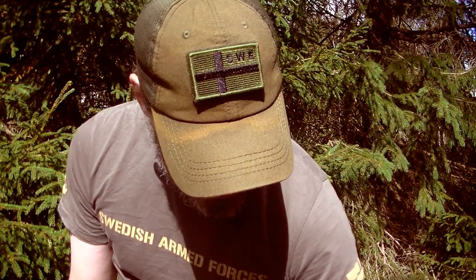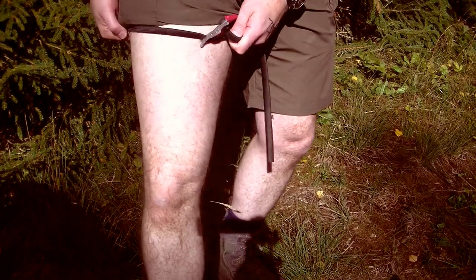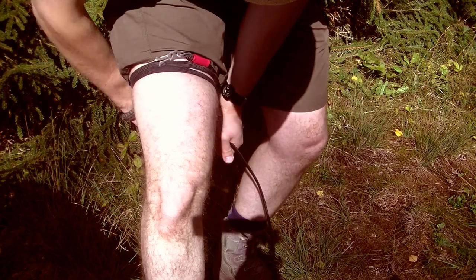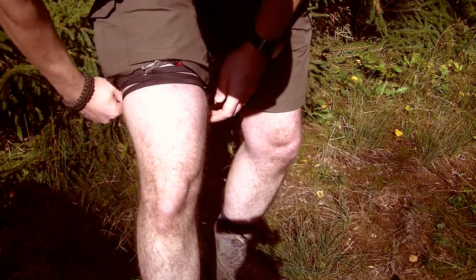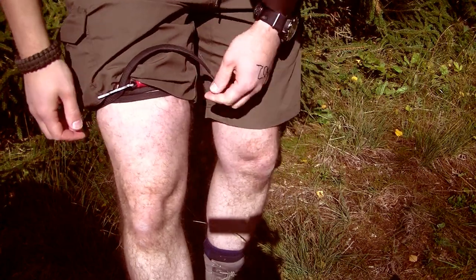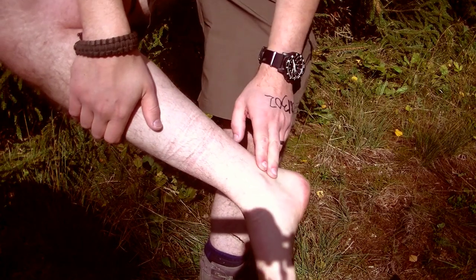The posterior tibial pulse is located down on your foot, so the problem is that you have to remove your shoes. There is another pulse you can check behind the knee, on your lower leg, called the popliteal pulse — I think it's called popliteal, but don't take my word for it, check it out.